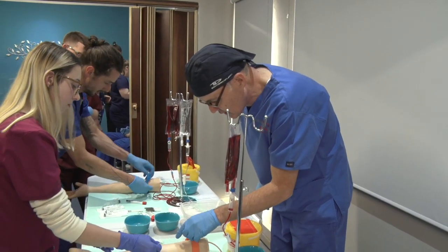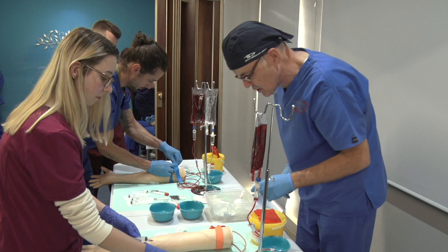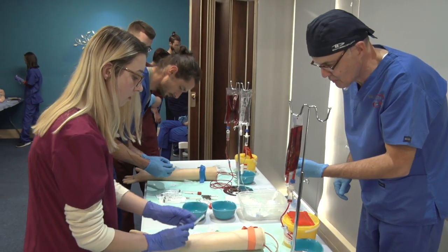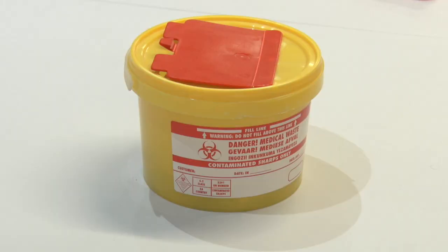Students get the opportunity to practice their newly acquired phlebotomy and IV skills while the instructors are ready to mentor, supervise, and assist. At the end of the workshop, the sharps are collected in appropriate sharps waste containers and the trash is discarded.